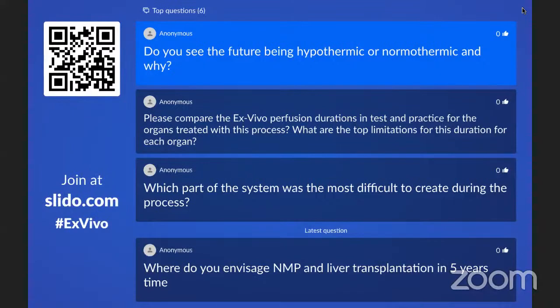But the warm perfusion also gives you more. You have no cold storage, you give oxygen, and you can test the organ, you get function parameters, and you also get much more opportunities to change and modify the organ. So actually, I see the future in a combination of those. I believe likely we will transport organs cold, perfused with oxygen, which can be done more easily in a smaller machine, with less energy involved. And then when we come to the recipient center, we will flip it over to a warm perfusion device, and then we keep it alive overnight and study it and do something. So I think the future is actually the combination of both. Transporting warm perfusion is tricky. Transporting cold perfusion is much easier, and we have to take the best of both worlds.